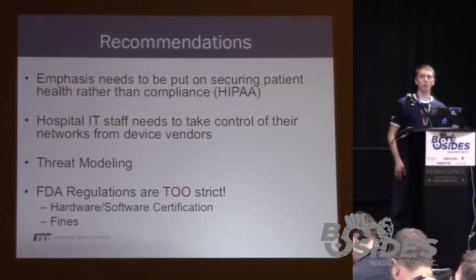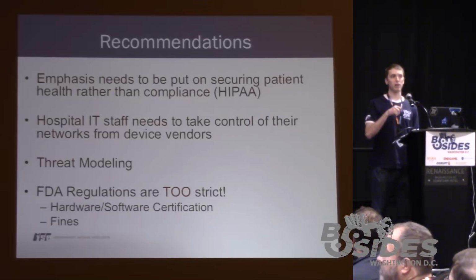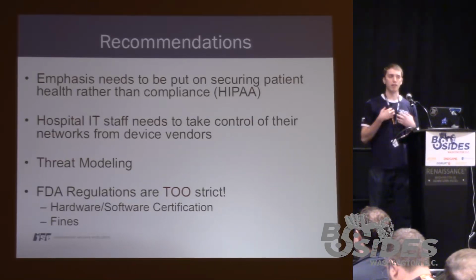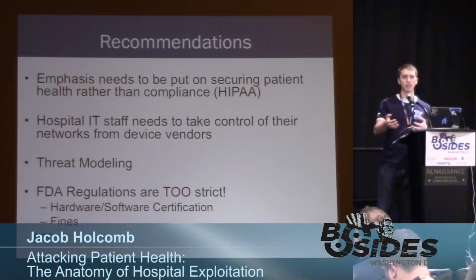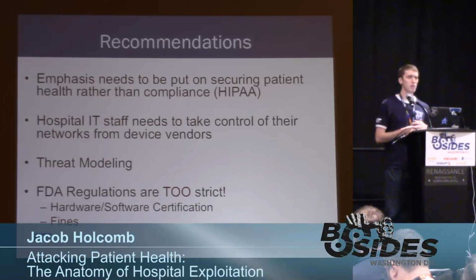Yeah. So really, most medical devices, and I'm going to make a point here. Most medical devices these days are IP enabled. They have the ability to be controlled over a network. So to your point, yes, it's definitely true. Now the devices that we looked at were passive devices, meaning that they were monitors. They didn't actively administer medications, other than that one medicine dispenser thing I talked about.